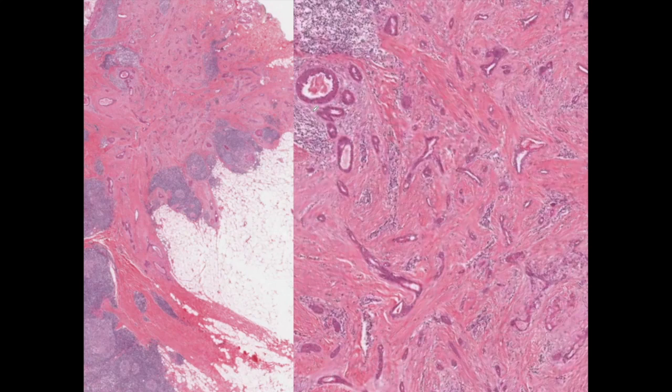And back to the case, the tumor is an infiltrative neoplasm characterized by tubular and follicular differentiation of eosinophilic epithelial cells in a sclerotic stroma. Cytologic atypia is focal, no lymphovascular or neural invasion is seen. Scattered lymphoid aggregates are present. There are three differential diagnoses: microcystic adnexal carcinoma, metastatic breast carcinoma, and apocrine carcinoma. By morphology, it looks the most like MAC.